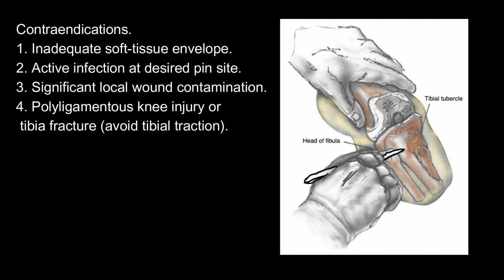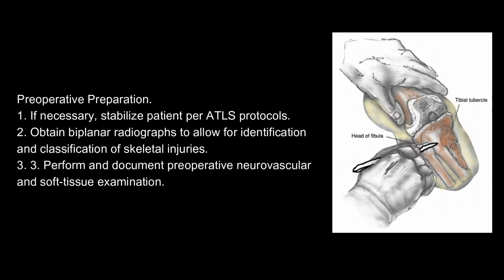Contraindications: 1. Inadequate soft tissue envelope. 2. Active infection at desired pin site. 3. Significant local wound contamination. 4. Polyligamentous knee injury or tibia fracture. Avoid tibial traction.